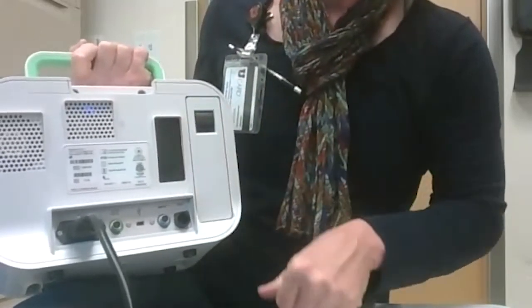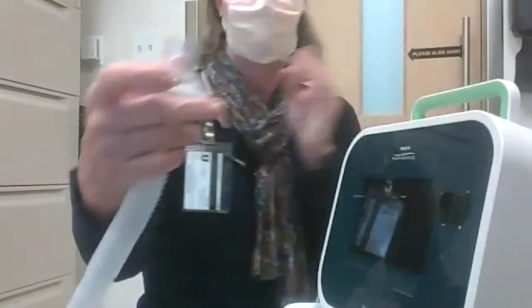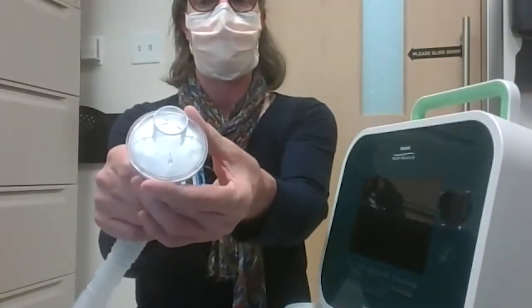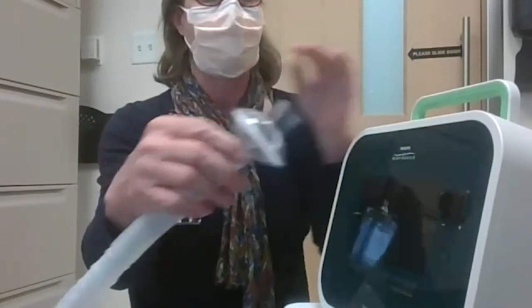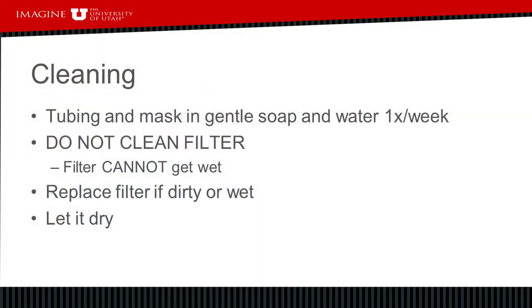You also want to make sure that the in-line filter is clear of any debris or fluid. To clean the cough assist machine, I would recommend cleaning the tubing and the mask once a week in soap and water — just submerge the entire unit into some water with soap. Do not wash the filter and don't get it wet; it will need to be replaced if it's dirty or wet.